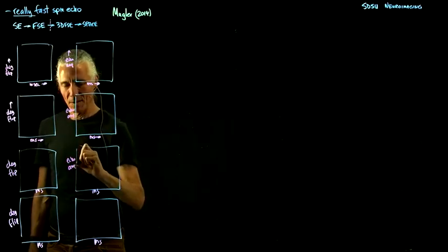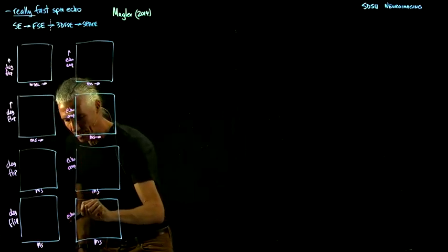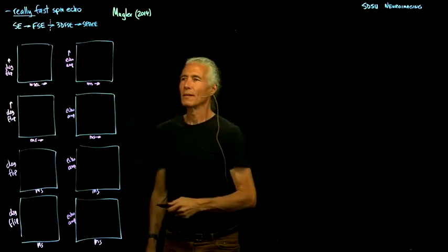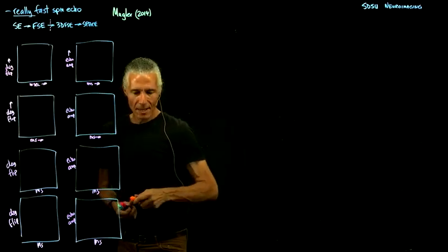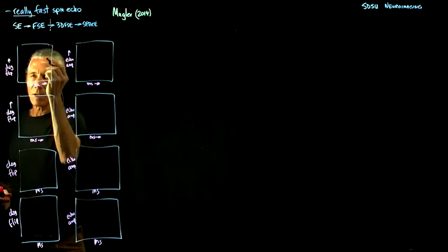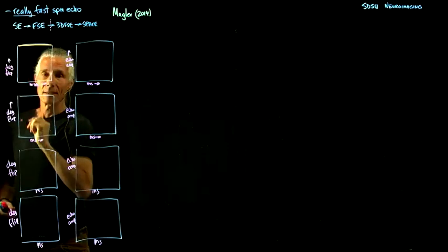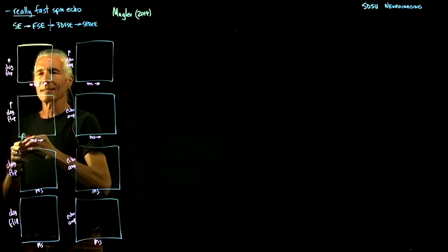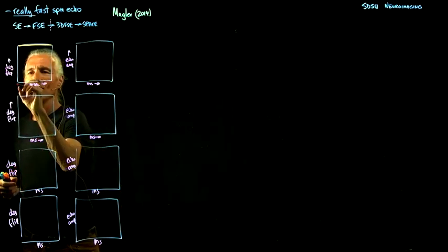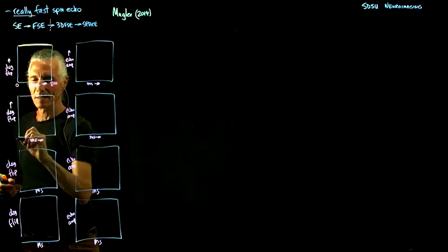So what is the actual strength of the echo? Also over time. So it's all over time. What is the first starting point, which would be like the 3D fast spin echo? Just do 180s. And then also, what is the axis here? We're going up to a really long time, 800 milliseconds. So 0 to 800.